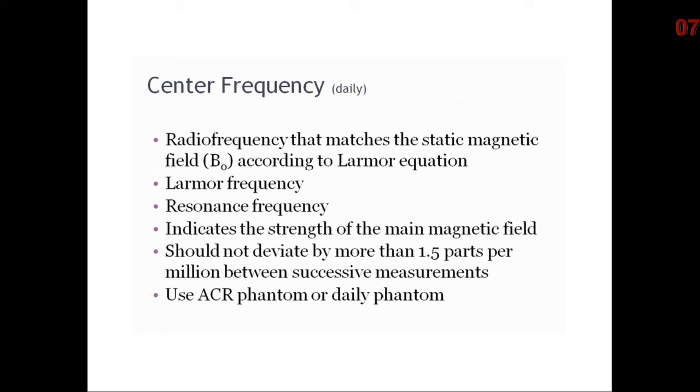Generally, the center frequency will be documented daily with the vendor QC phantom, and also again weekly with the ACR accredited phantom.